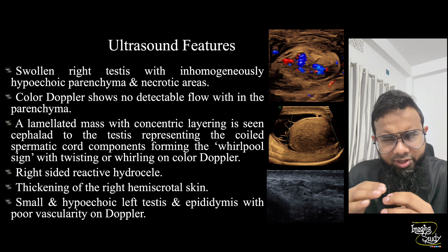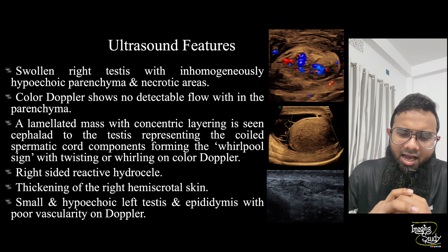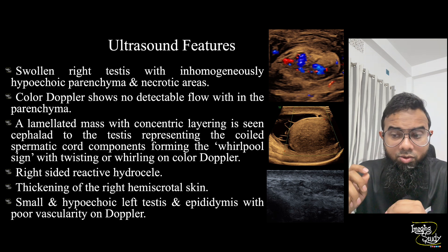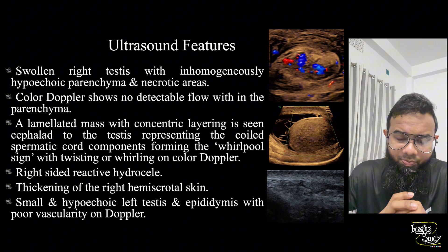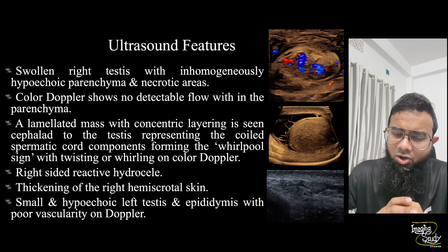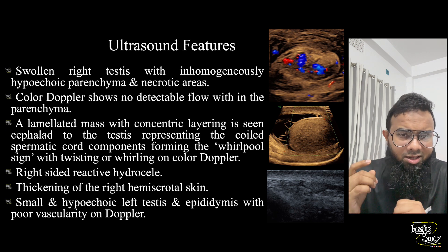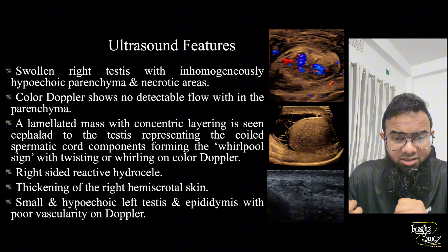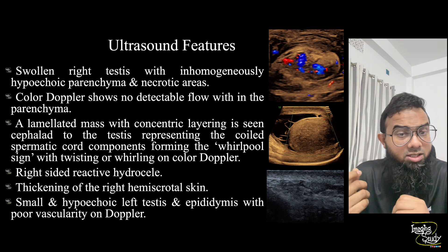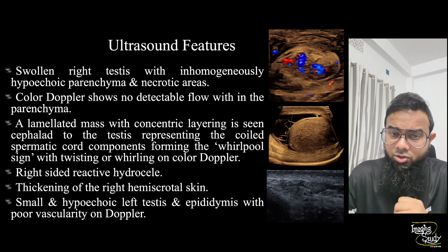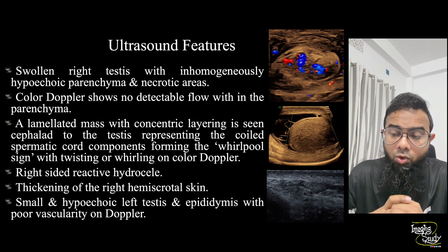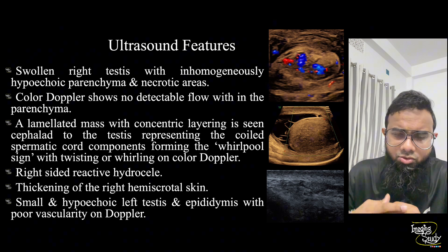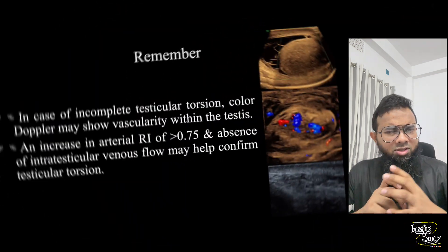The right testes also showed surrounding hydrocele containing thin septations, and the scrotal skin was slightly thickened on the right side. On the left, we found a small hypoechoic left testes with a small epididymis. Color Doppler showed very poor vascularity on that side — consistent with chronic epididymal orchitis on the left.